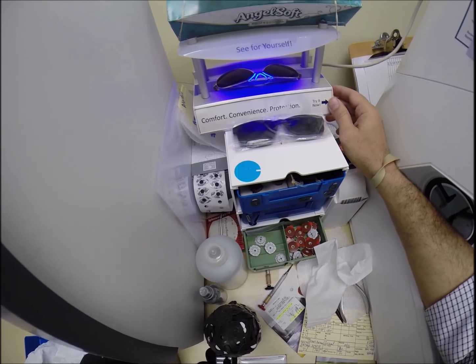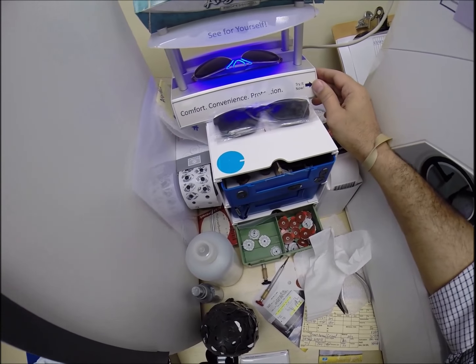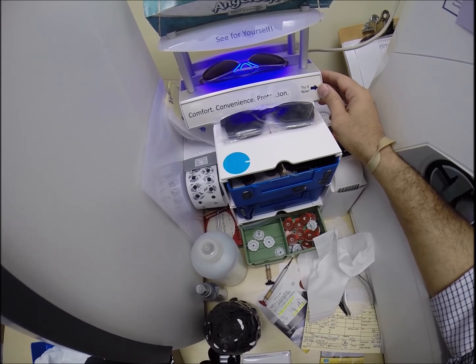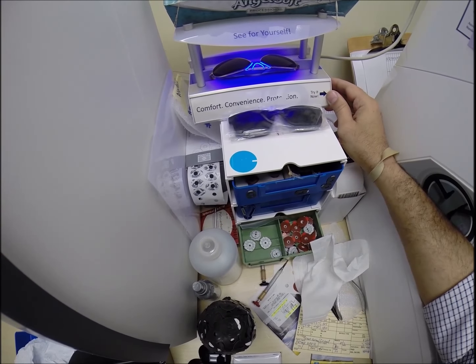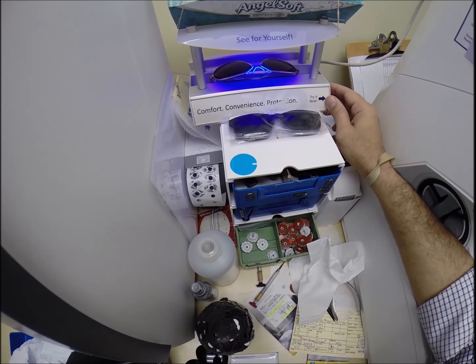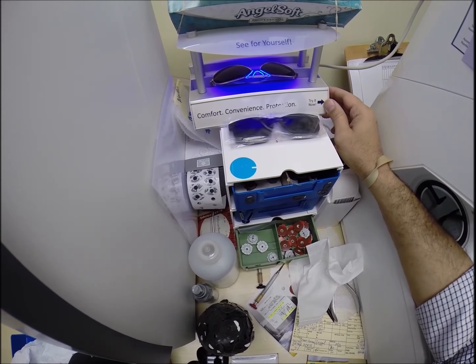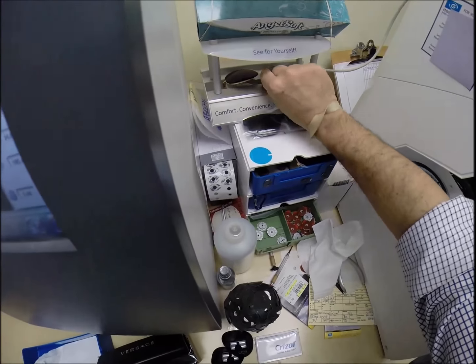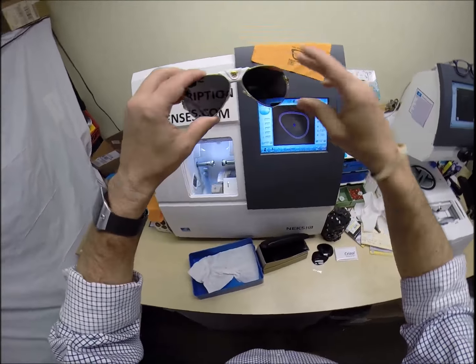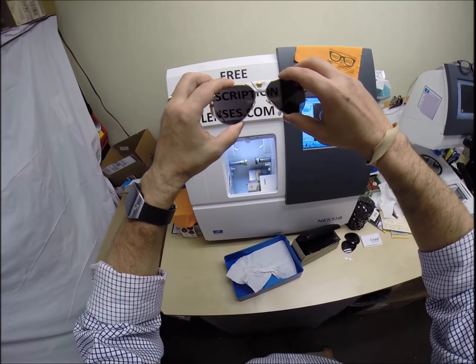The only time transition signature 7 lenses don't work is if you're behind the windshield of a car. Your windshield absorbs all the sun's harmful ultraviolet light that would cause your dashboard to crack from sitting in the sun all day, and that's why they don't turn dark in a car. Now, they're also temperature sensitive, meaning they will turn darker when it's 85 degrees and below than they will when it's 95 and above. But I remind everyone, when it's 100 degrees outside, you're miserable, they're miserable. Nobody likes to work 100% when it's 100 degrees outside. Of course, in Houston, that is a real concern, because I know it gets hot as all get out down there.